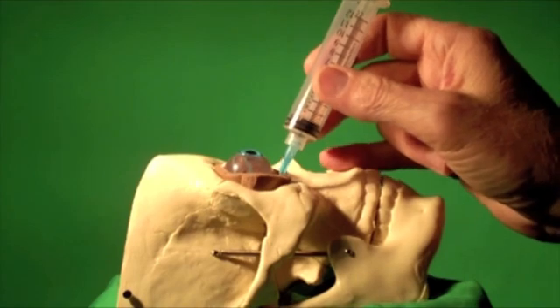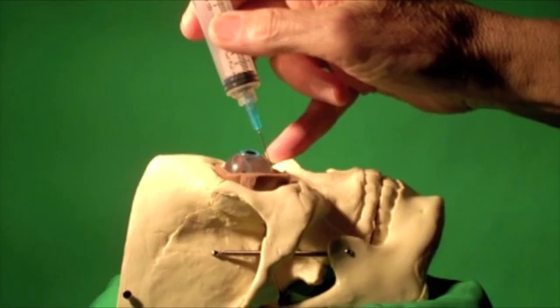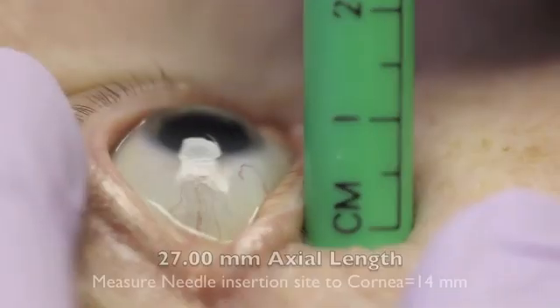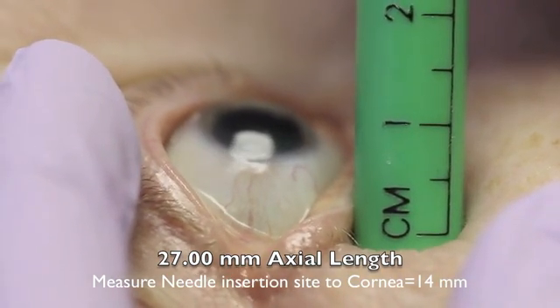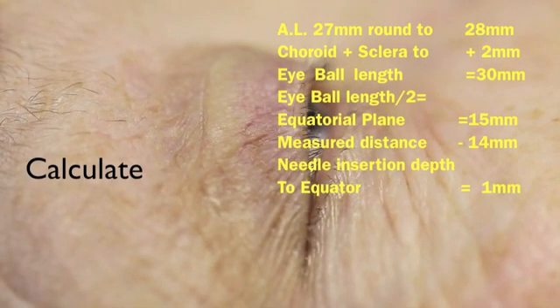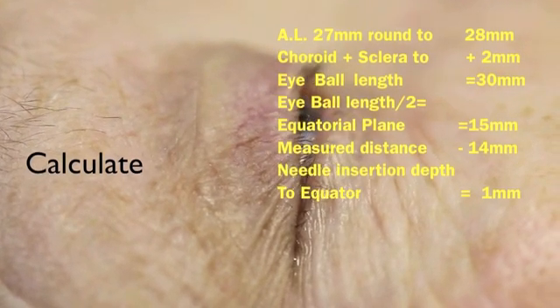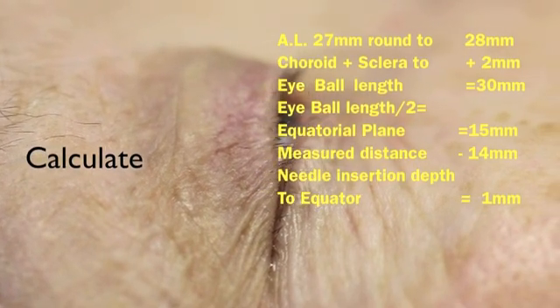Stage 1. Insert the needle tip with the bevel towards the globe 2 millimeters lateral to the limbus and 2 millimeters inferior to the globe at 120 degrees towards the orbital floor through the skin. Stage 2. Redirect 90 degrees and slowly advance the needle tip posterior, passing the calculated equatorial plane of the globe in the extraconal space. Stage 3. Rotate the needle tip cephalad until the shaft of the needle rests on the infraorbital rim. Then slowly advance the needle tip into the intraconal space.